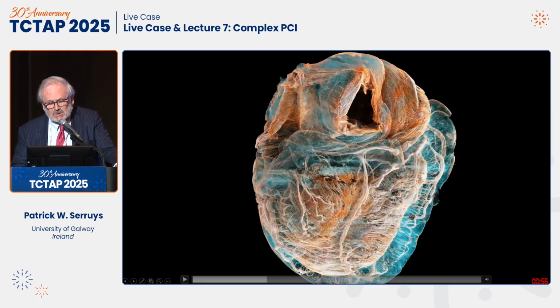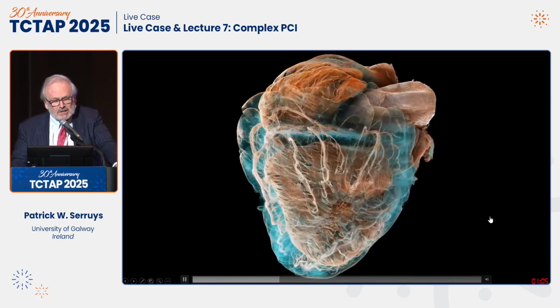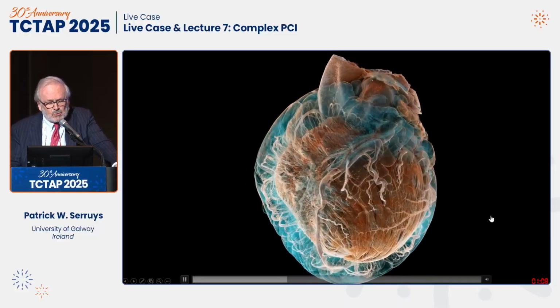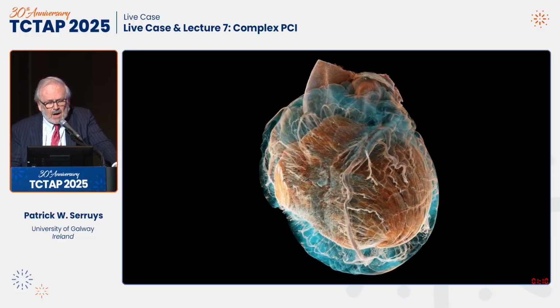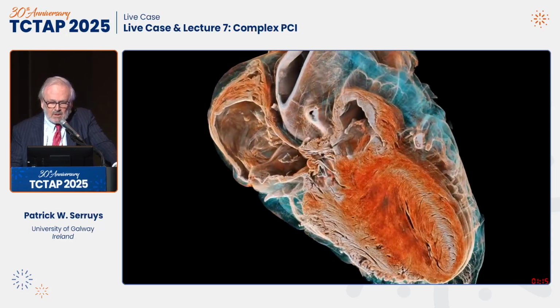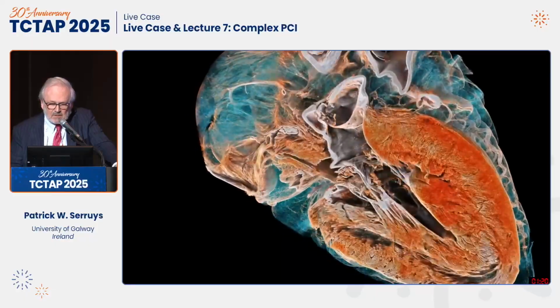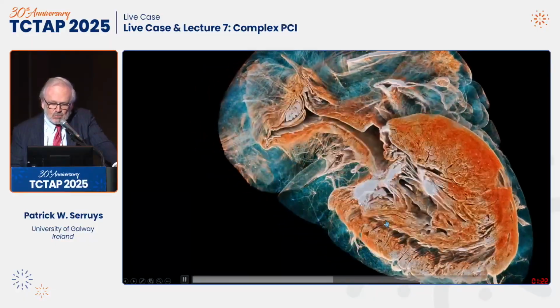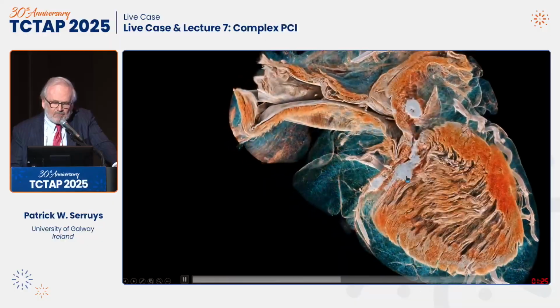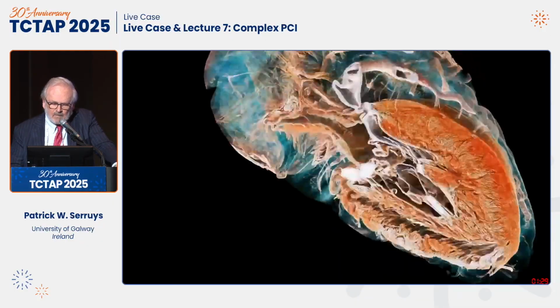Can you have an increase in the microcirculation just by the compression of the vessel to the fat? We can keep going to looking at this heart in great detail. We can go through the myocardium, see the area of ischemia in black. You will see in a second. This is where you have some ischemia in this heart. Here, the scar of the tissue, the chordae, all the valve, all the structures, back and forward.